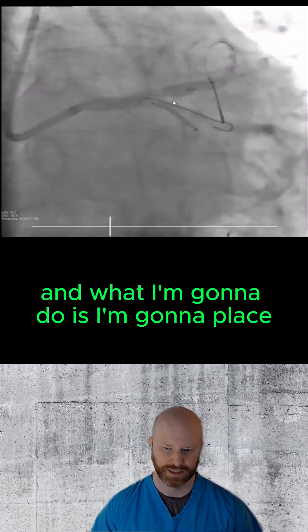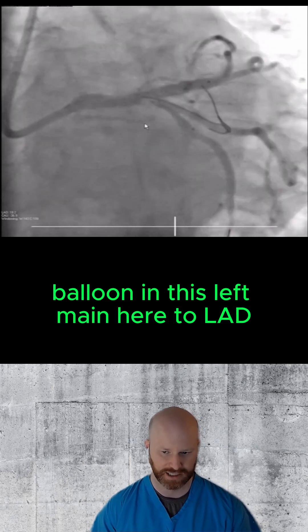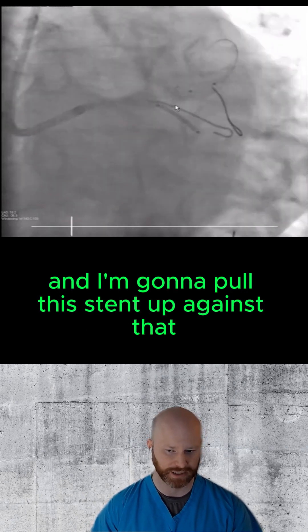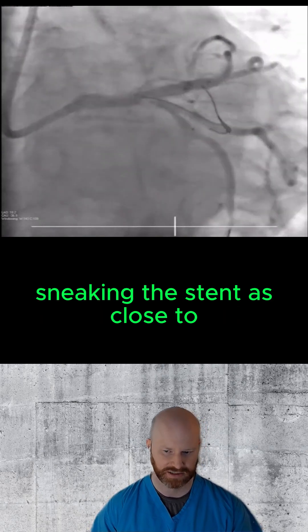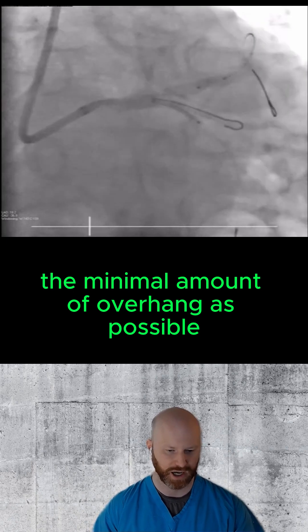I'm going to place a one size — or a quarter size — undersized balloon in this left main to LAD. I'm going to take that to a low atmosphere and pull this stent up against that, with the idea of sneaking the stent as close to the minimal amount of overhang as possible.